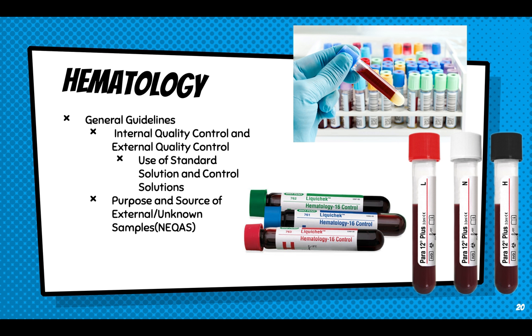So before you run your samples, you need to do your quality control. Unlike other quality controls, like in your clinical chemistry, where we only have two, except for electrolytes, we have your low, your normal, and your high controls. But for hematology, we always have three controls or three parameters. As you can see, they are different in color. This one is high, this one is low, the other one is normal. Similar to this one that you see on your screen, we have your low control, your normal control, and your high control. This is very important.